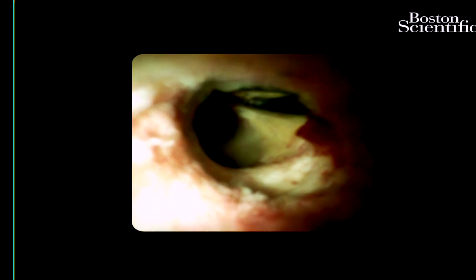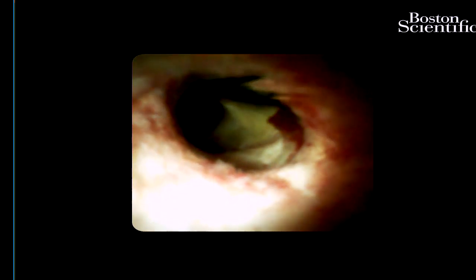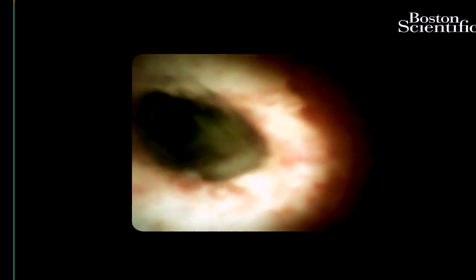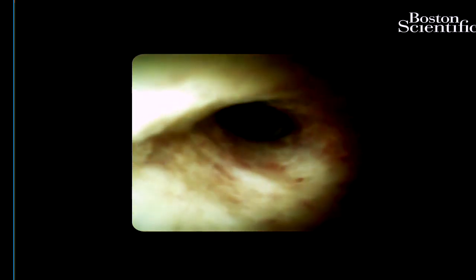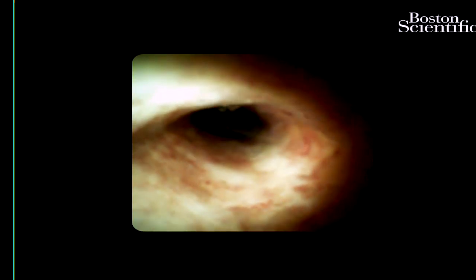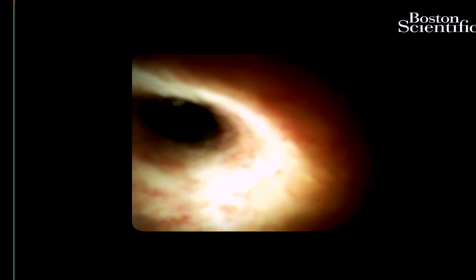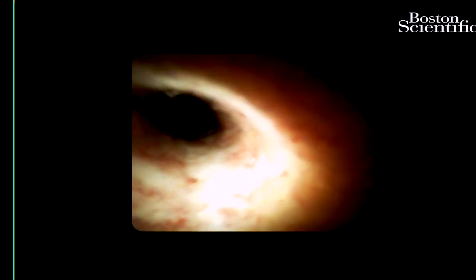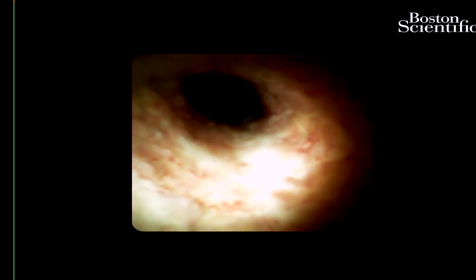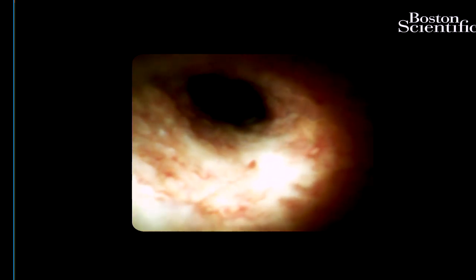In order to clarify a little bit, we can see an irregularity of the wall with some kind of infiltration and neovascularization also. And a lot of fibrotic areas. You can see here down, at 6 hours, the neovascularization areas. With a lot of fibrosis, as my good friend Isaac Reichman always says, you just pass with the scope and this starts to bleed.